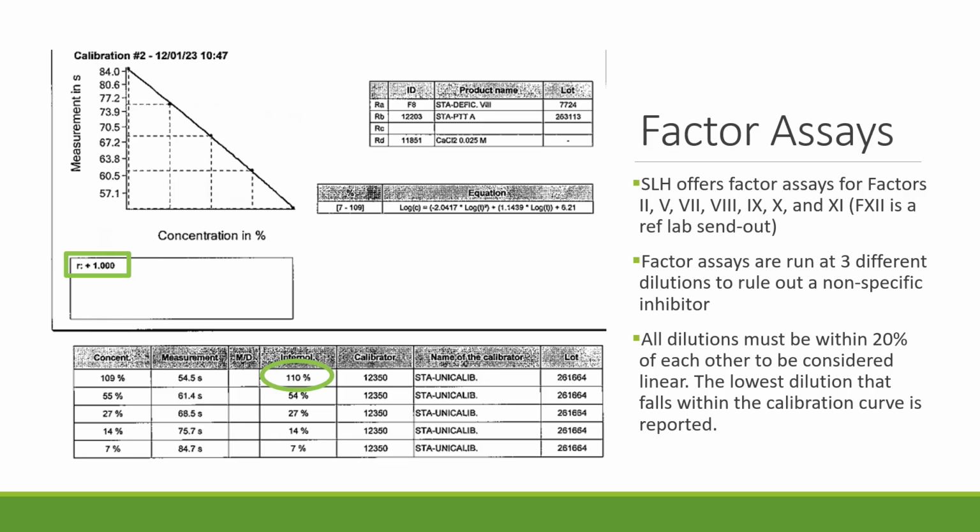But either way, the beautiful thing about calibrations is that the calibration numbers come in an acceptable range from the manufacturer who produced the reagents, and the calibrations have been repeatedly tested for accuracy and precision so that we have a nice distribution of data points and we can confidently say that this calibration curve is accurate and precise and that the concentrations found there are going to behave appropriately.